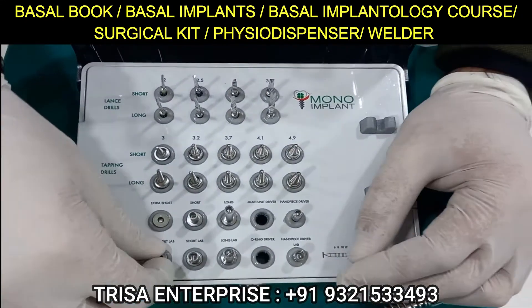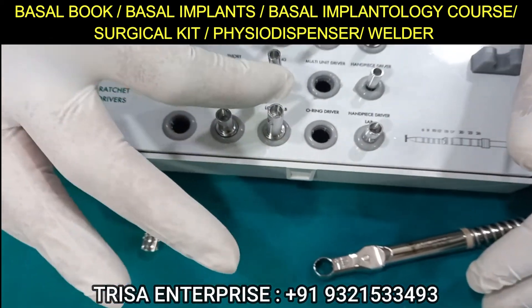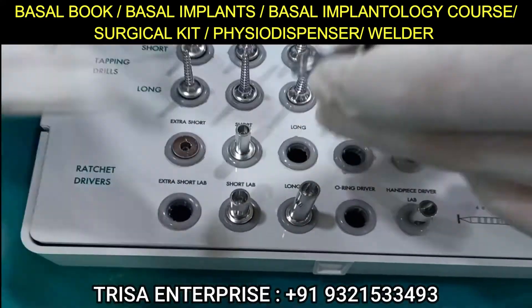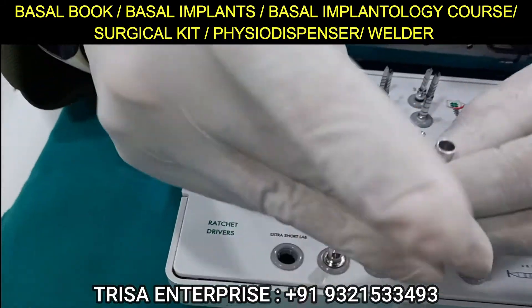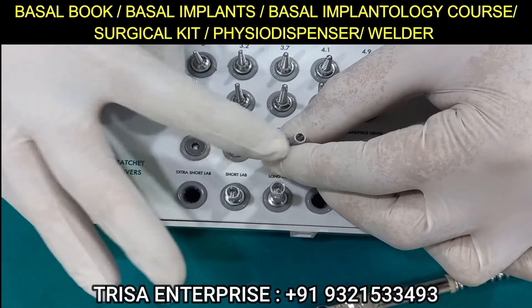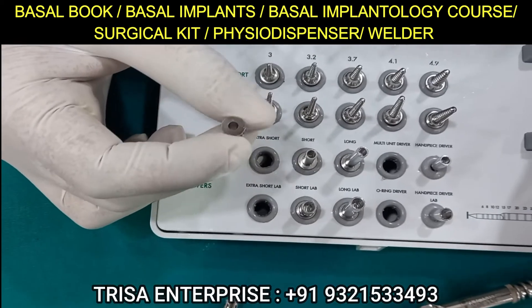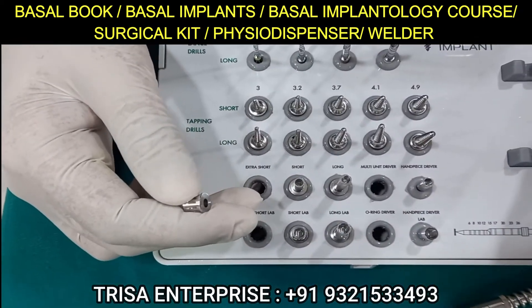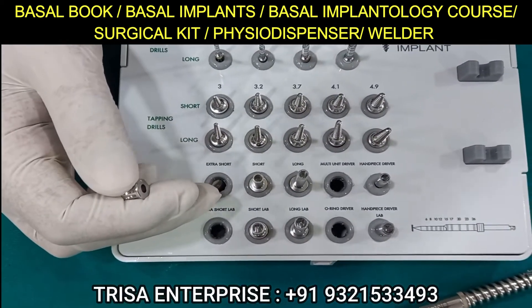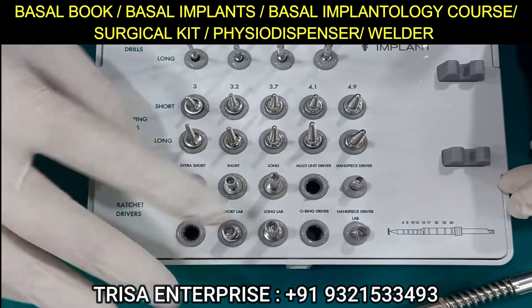There is a long driver and a short driver — a large head and a small head. There is a long driver for the large head and one for the regular head. Similarly, there are drivers for the regular head in long, short, and extra-short versions. In OSMF cases this is really helpful for lower six and lower seven where mouth opening is limited; otherwise the driver itself may be obstructed by the upper eight, making it difficult to work. For good mouth opening I would always prefer the longer driver.